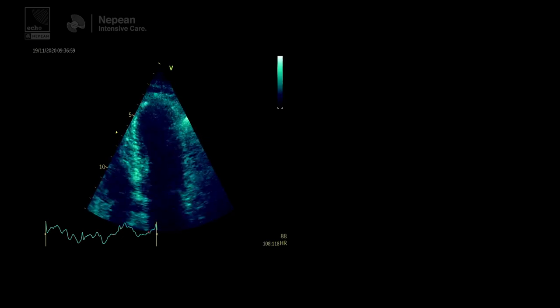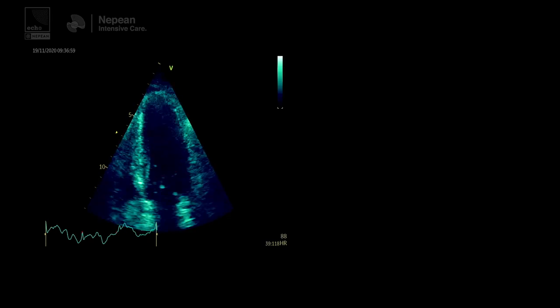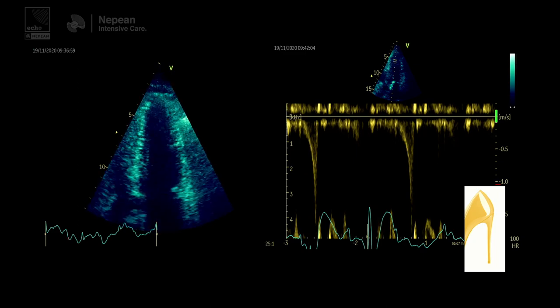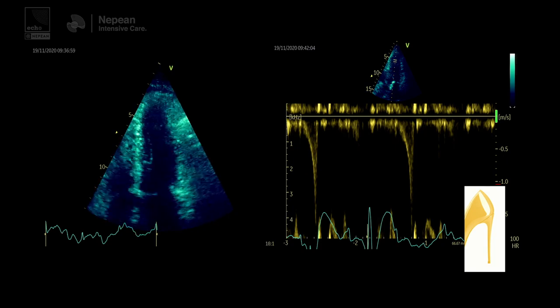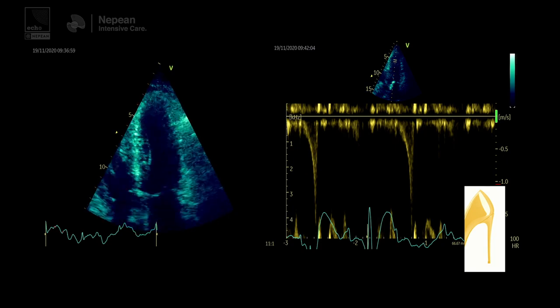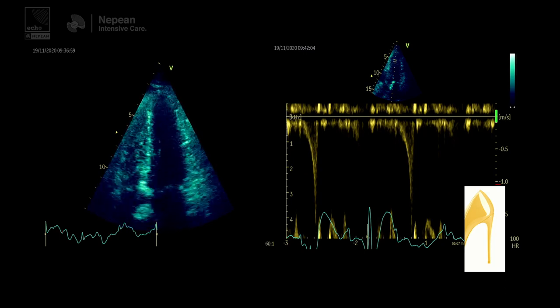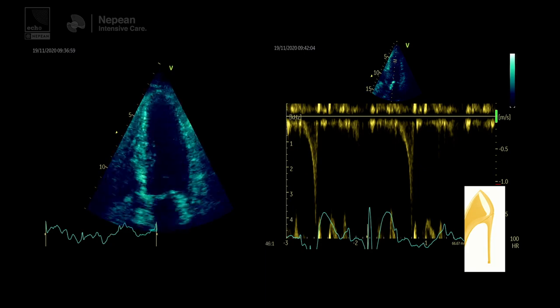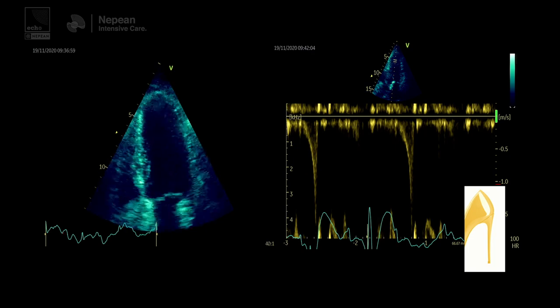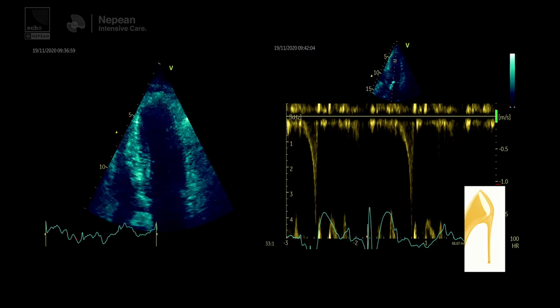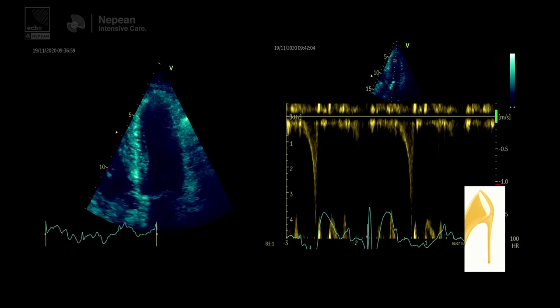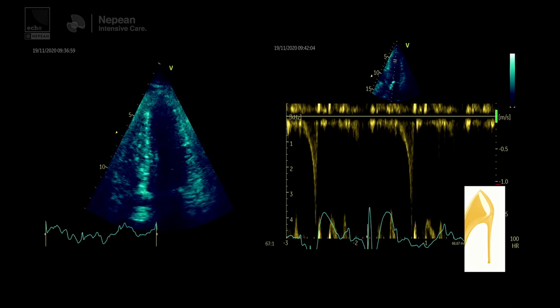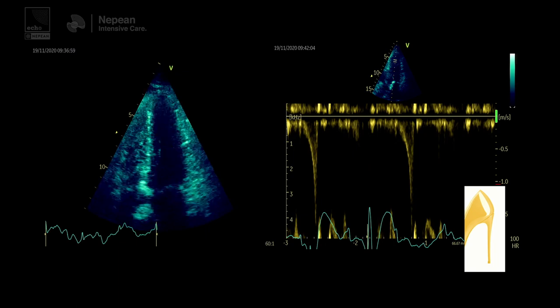We'll have a whole session on obstruction — it can be apical, mid-cavity, or at the LVOT, all looking different. This patient has a preserved ejection fraction, slightly hyperdynamic, and using pulse wave Doppler to look for where the gradient is, they get a classic late-peaking profile. In the mid-cavity it often looks like a stiletto heel — quite different from LVOT obstruction where you get the dagger shape. Mid-cavity obstruction tends to be very sharp, late-peaking, and at a lower velocity than LVOT obstruction. If you look for this you'll see it in a lot of our patients. Often a bit of fluid and cutting back on the catecholamines is what they need.